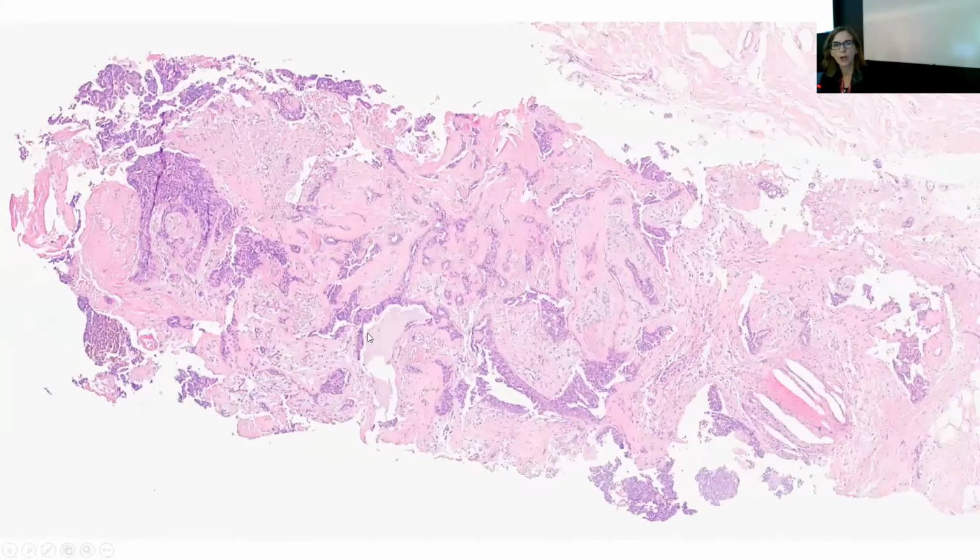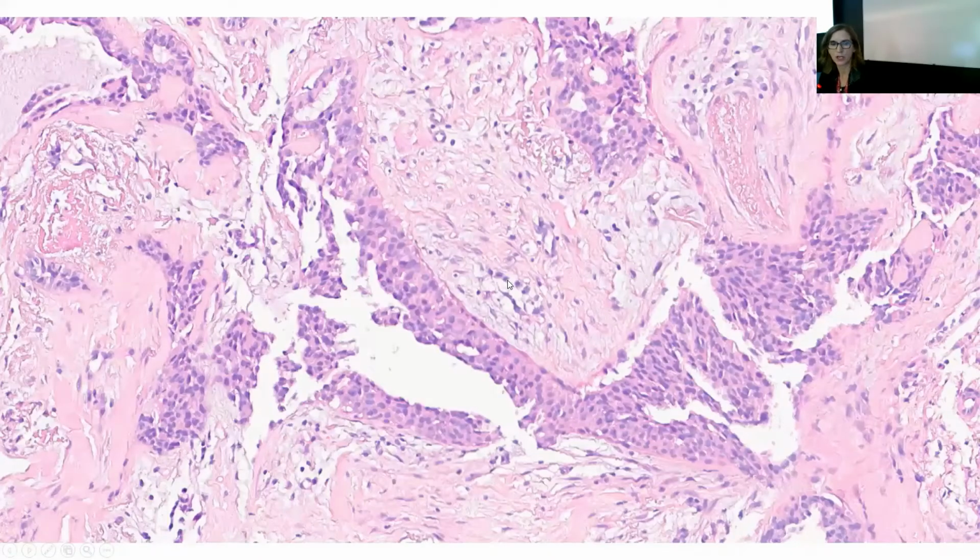This one, I think, more like complex sclerosing lesion because it's less well-formed. There's not so much a single central nidus. It's more irregular. So in that kind of setting, I tend to use the language complex sclerosing lesion. From a radiologic perspective, radial scars are 1 centimeter or smaller, and complex sclerosing lesions are larger than 1 centimeter. I don't think we have those criteria quite so strictly defined in the pathology literature.